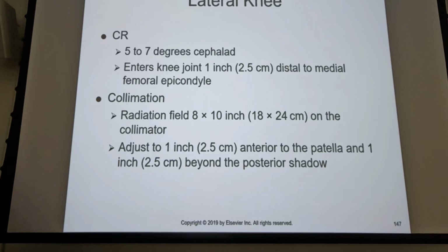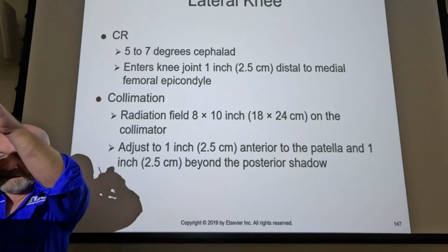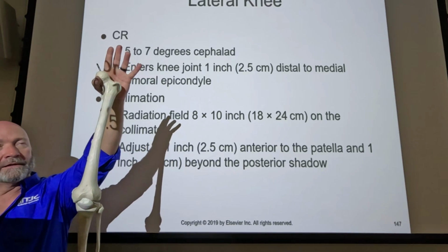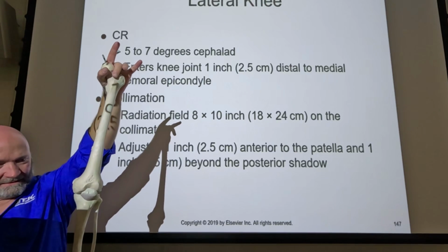And this is why. I think I'm just going to have to take that patella off. There we go. All right. So as he's a little bow-legged, as I hold this, what do you notice in my femoral condyles? Can you see anything?